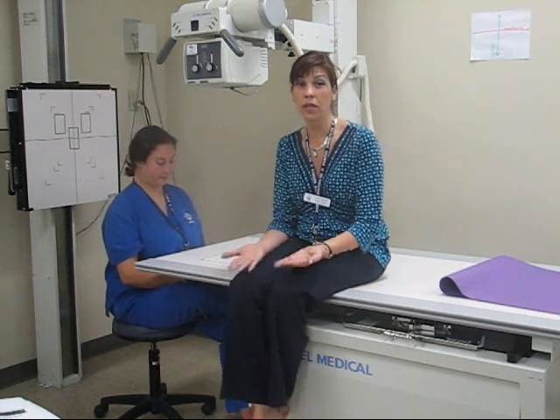Some tricks are easy. SID is going to be either 40 or 72. Anything that you do on tabletop is going to be 40. Chest is about the only thing you have to consider at 72 inches. So, keep that in mind. Don't waste too much time with that.